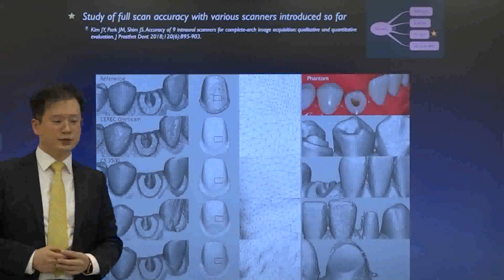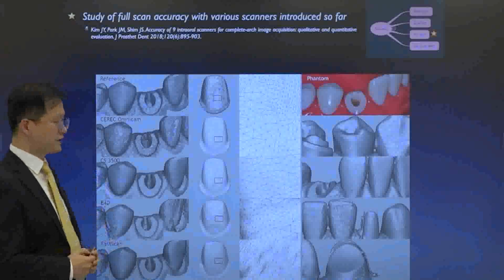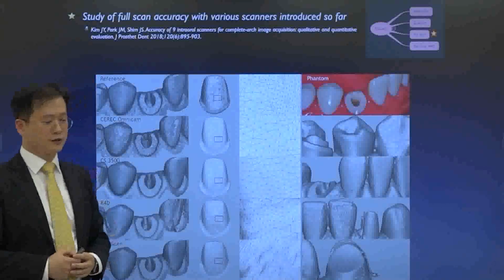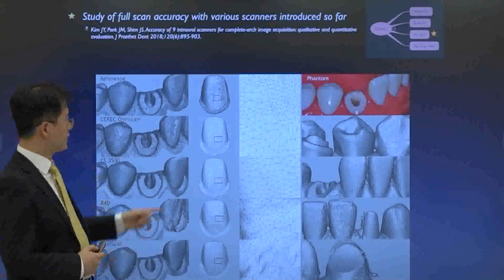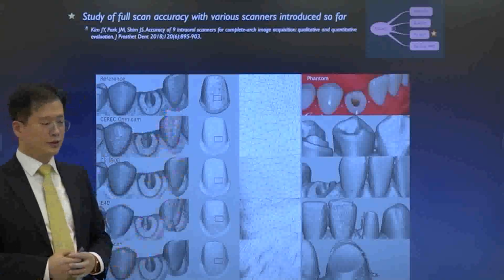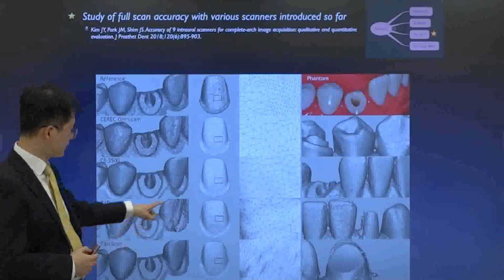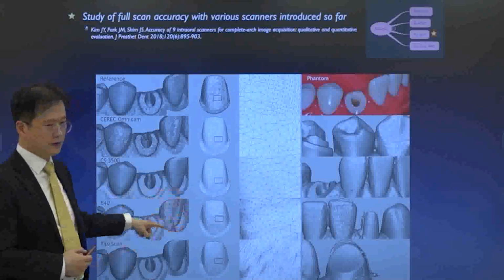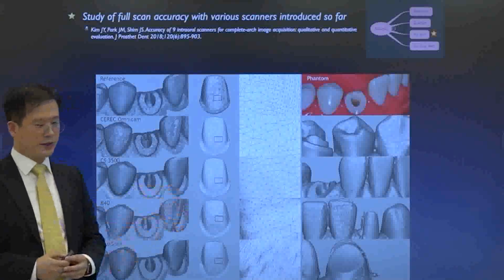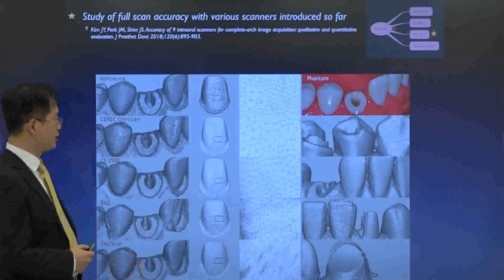If you look at the same position for each intraoral scanner, you can see that various aspects of intraoral structure are represented on the same tooth. Like the traditional method, there are various errors in the digital impression, such as those shown in the photo pictures, as well as deformations of the rubber impression body.